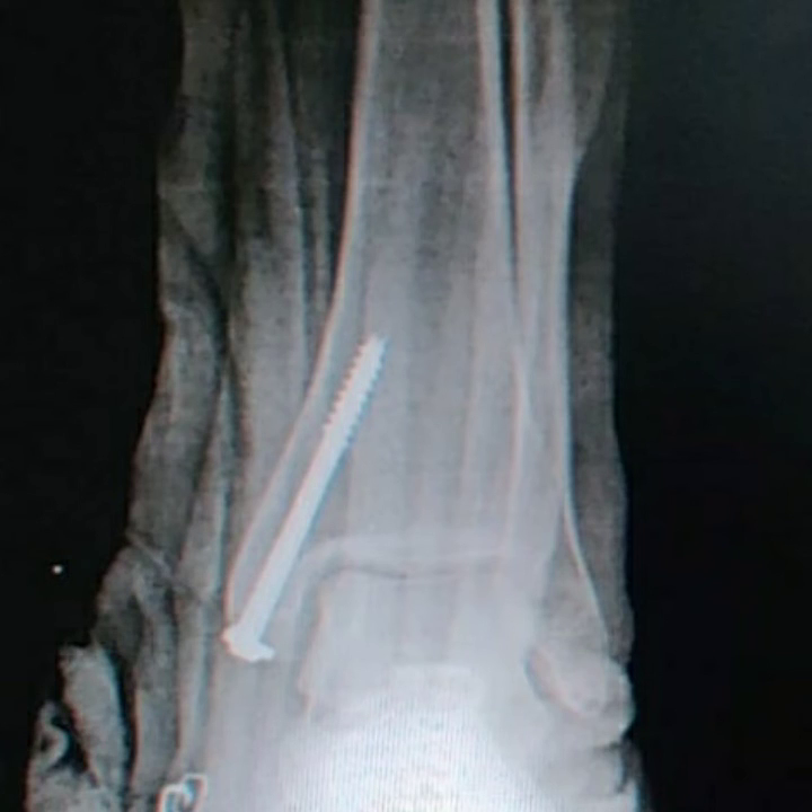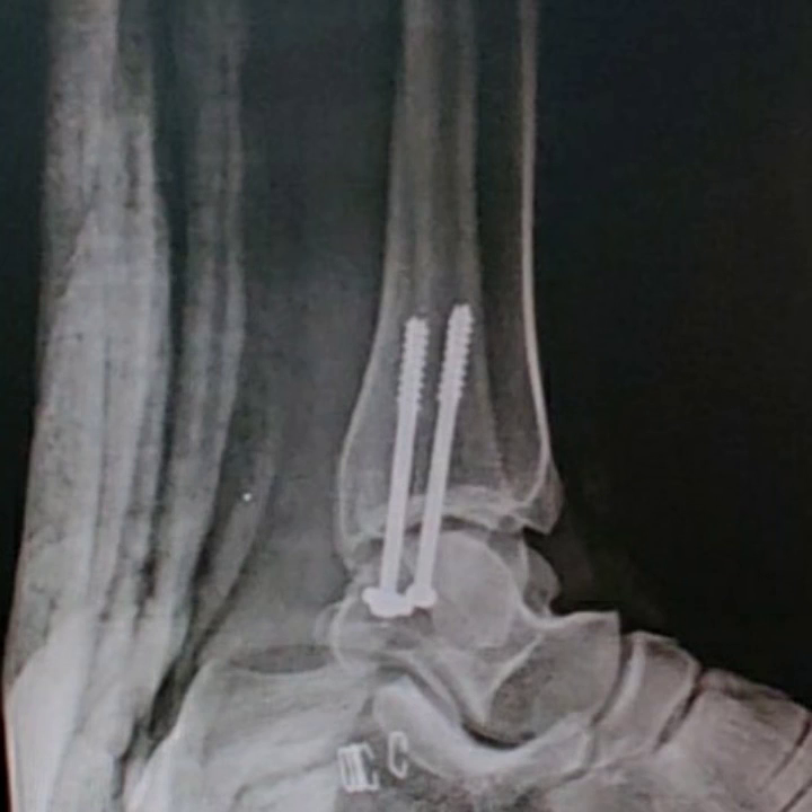Final X-ray picture of closed reduction of medial malleolus fracture, confirming satisfactory fracture reduction.